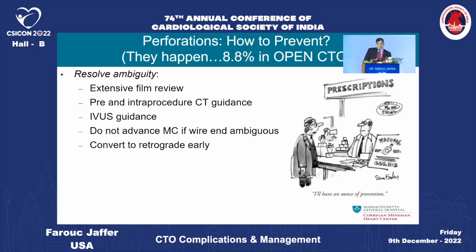So let's talk about perforations, which are the most frequent complication that we have and expect. When we have a perforation, especially when they're elective cases, there is this sense that it's hard to take a patient in electively and have destabilization. But this is the natural history of complex coronary disease. And rather than beating oneself up about it, it's really just important to recognize they're going to happen and be skilled at managing those complications.